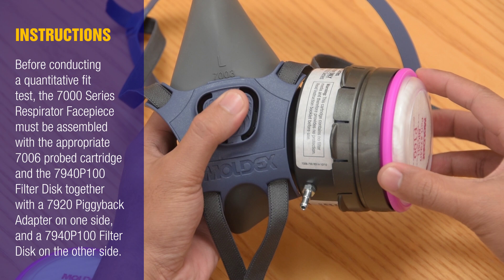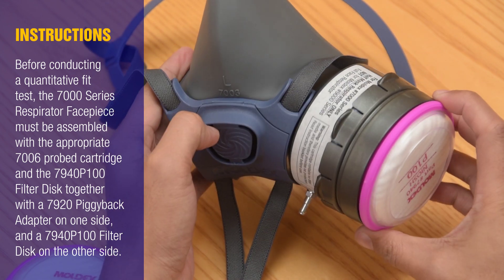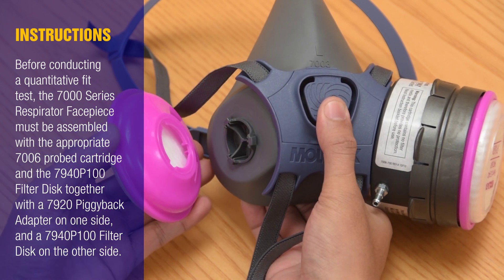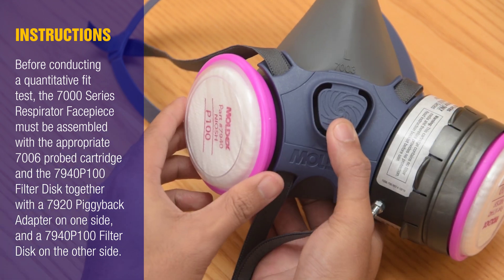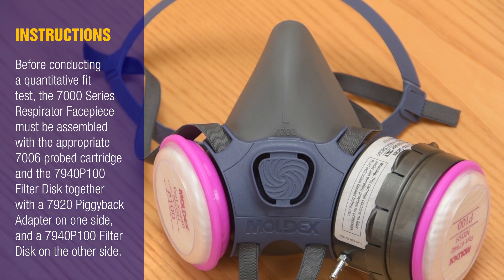Before conducting a Quantitative Fit Test, the 7000 Series Respirator Face Piece must be assembled with the appropriate 7006 Probed Cartridge and the 7940 P100 Filter Disc together with the 7920 Piggyback Adapter on one side, and a 7940 P100 Filter Disc on the other side.